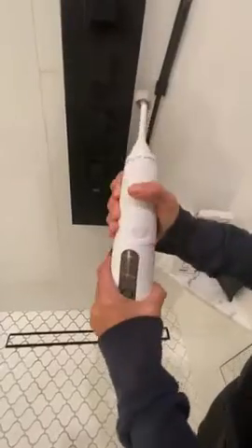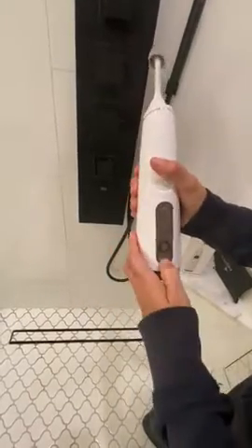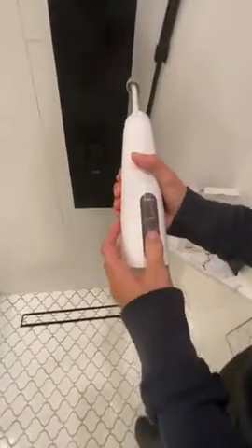You can fill it up either by taking the entire thing off, which is what I do, or you can just flip this down and fill it that way.